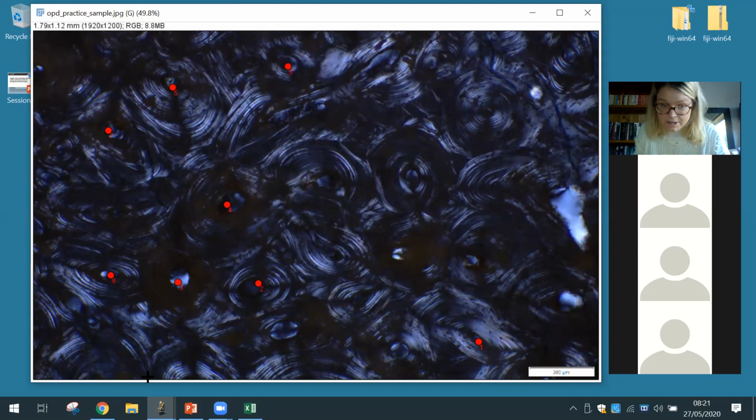Here at the bottom of the picture, you can see there's an osteon here, one there and one there, but obviously we can't really tell whether they're intact or fragmented. So as a rule of thumb, I exclude them. I only counted or measured what I could confidently identify. I'll probably say this one looks intact as well. Okay, so for now, let's just stick to these.